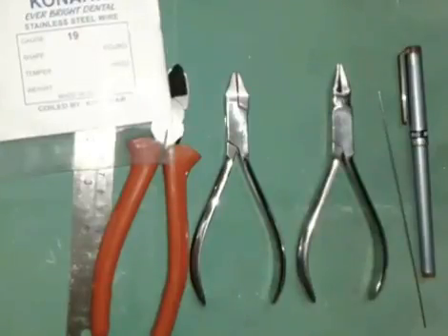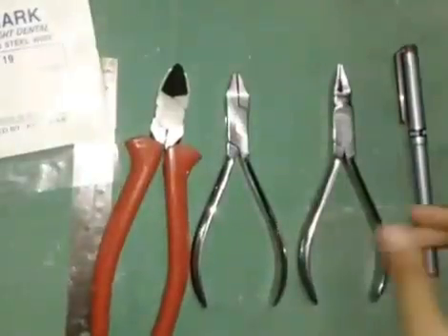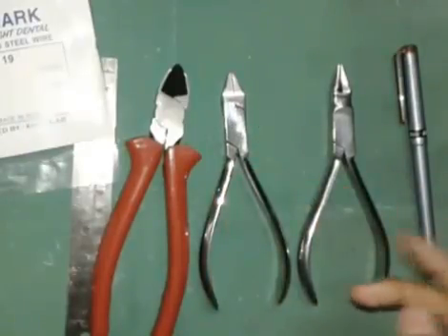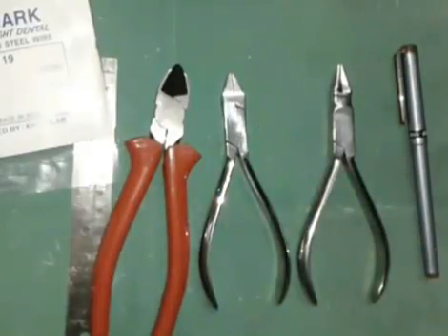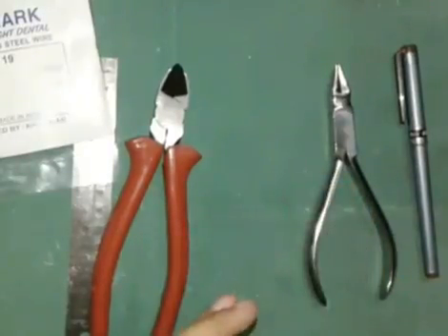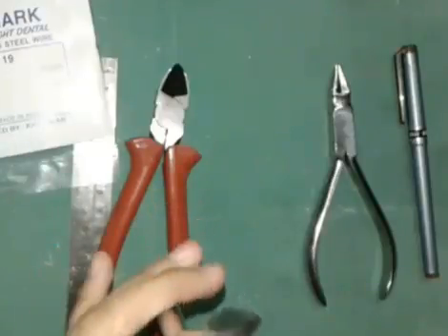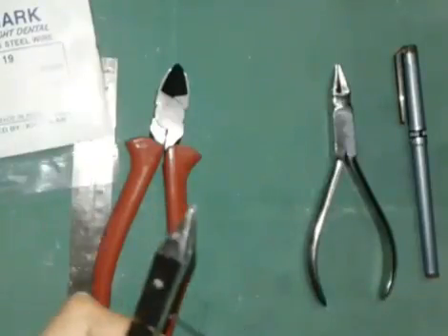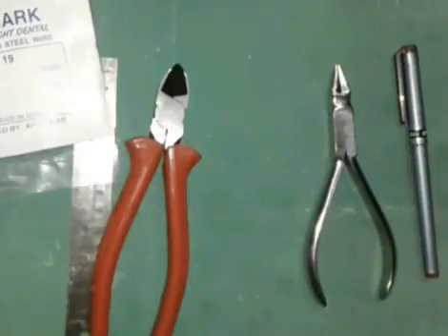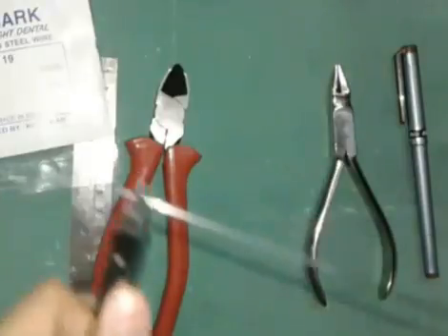Now we are going to start our new video today. First we want to continue the wire bending. We want to take either of the pliers, that is the universal or Adams. I will take the Adams plier, which is more comfortable to straighten my wire. I am using this Adams plier, but someone also uses the universal plier too. We can try either of these two pliers.